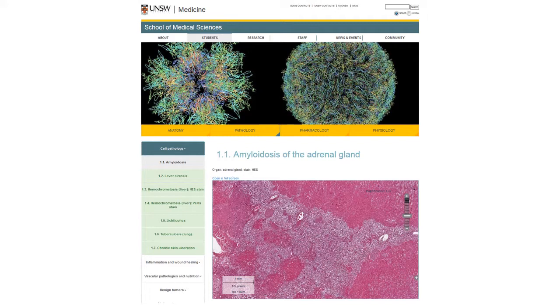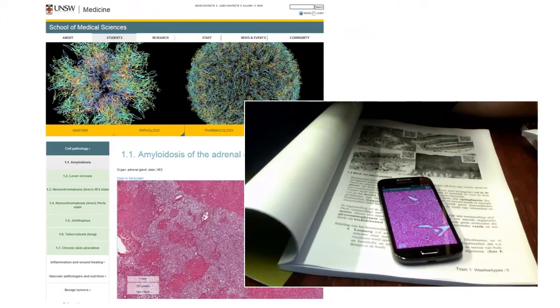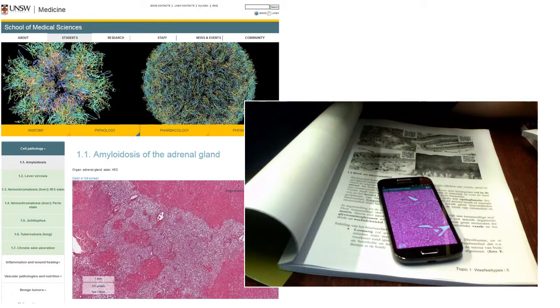Consider the convenient alternative. You obtain digital copies of your slides and embed them into a web-based version of your course textbook. The slides are available to anybody at any given time, and there is no capacity problem in terms of concurrently available microscopes. The digital slides can effectively be incorporated in your textbook. Each printed snapshot can now be provided with a QR code. When scanned, the QR code takes a reader directly to the site where the slide shows up in live colors and can be explored in more detail. Of course, the student website can contain whatever content, slides, and design style you want it to be.